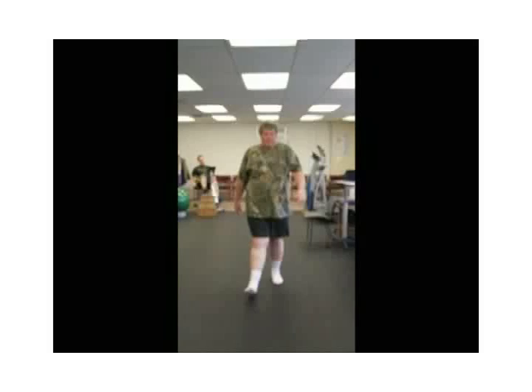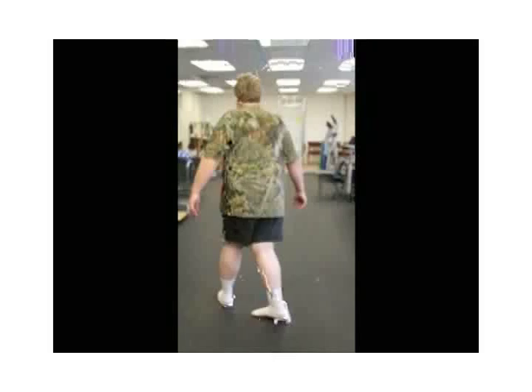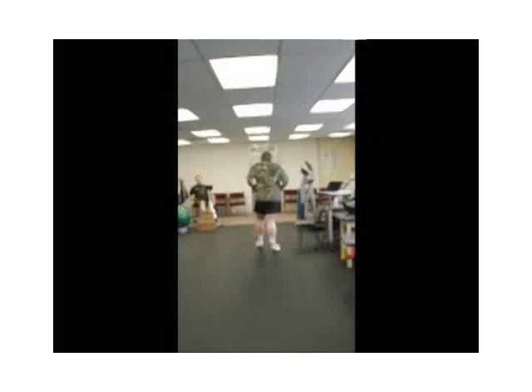So we ended up, after failing all the viscosupplementation and the arthroscopy and knowing with the fact that these lesions were going to progress, and this had to be his good knee, we ended up resurfacing him. And then at 3 months, literally, he made this his good knee. And he literally, as you could tell from his gait, relies on that knee, not only to walk and function, but get back to work.